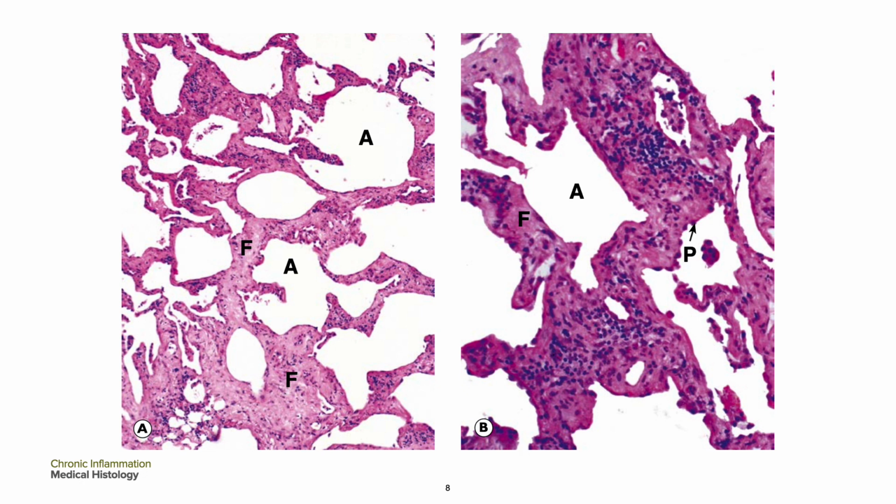This micrograph is showing you idiopathic pulmonary fibrosis, or cryptogenic fibrosing alveolitis, which is a good example of a chronic inflammatory condition that in its earliest phases has a chronic inflammatory infiltrate. At this early stage, it may be called interstitial pneumonitis or usual interstitial pneumonia, where an unknown damaging agent repeatedly triggers the inflammation of your alveolar walls, which leads to extensive fibrosis as part of the healing process.